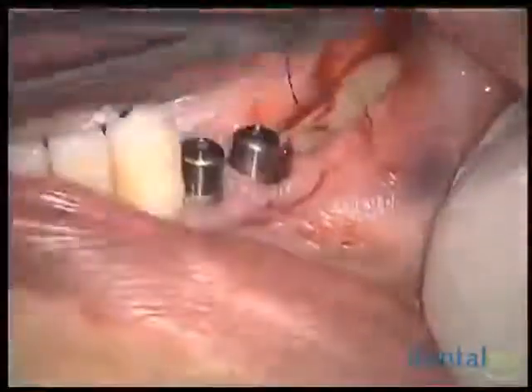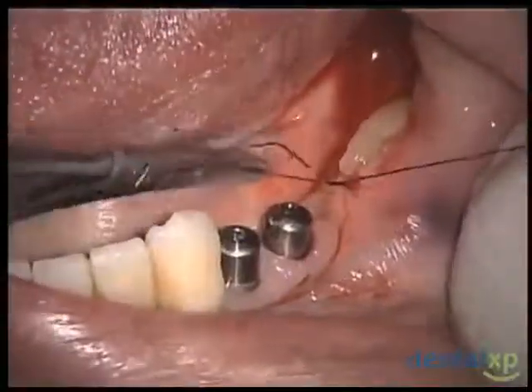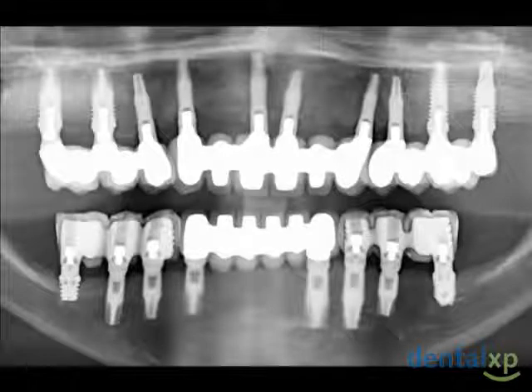After the healing period has been achieved, the implant restoration was performed. We can see the implant on the final radiographic image where the implant has been restored and is in normal function, and we can see how the short length implants allowed us to treat this case perfectly.